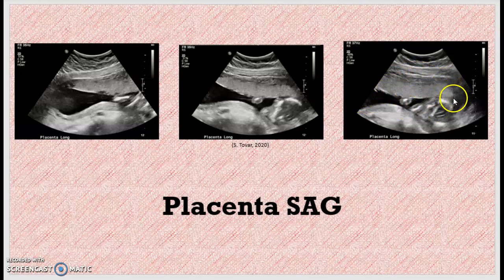On this image here, I think I could have probably got this a bit more clear and cleared out the borders here because it is kind of fuzzy. And same thing with this one, I believe. It's not as clear. I mean, you can tell where the placental edge is. It's just not as clear as I would want it to be.